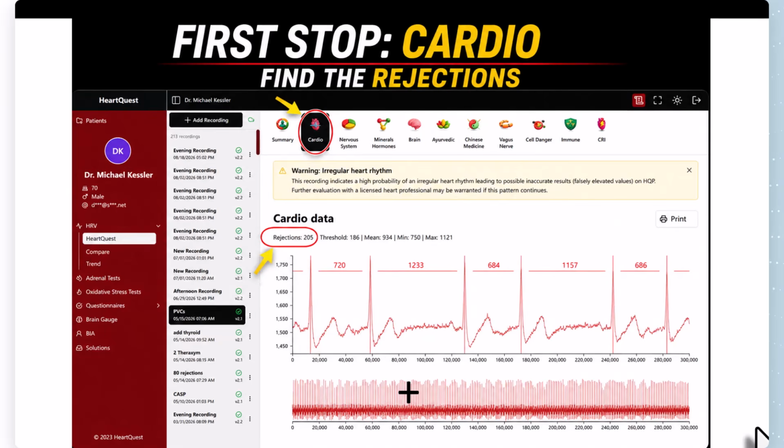Heart rate variability. What are we looking at in heart rate variability? We're looking at the difference between one R wave to the next. As you see, there are those little peaks, and we're measuring it in milliseconds, and it's going to make it look like there's lots of variability. That sympathetic and parasympathetic are pushing back and forth against each other, one speeding up the heart and one slowing down the heart, and it's going to make it look like with an arrhythmia or an abnormal rhythm there, it's going to make it look much better, a much better heart rate variability.